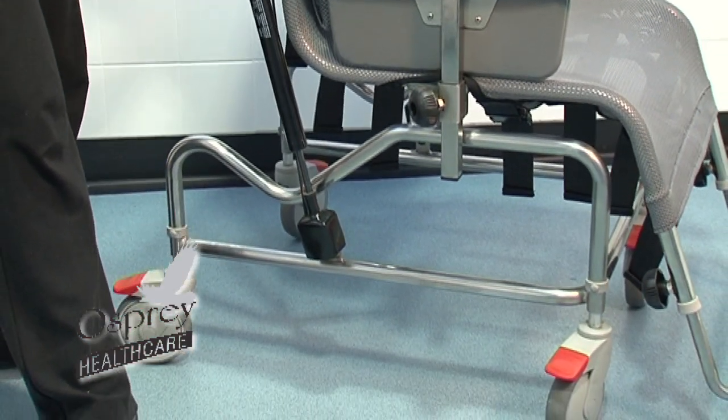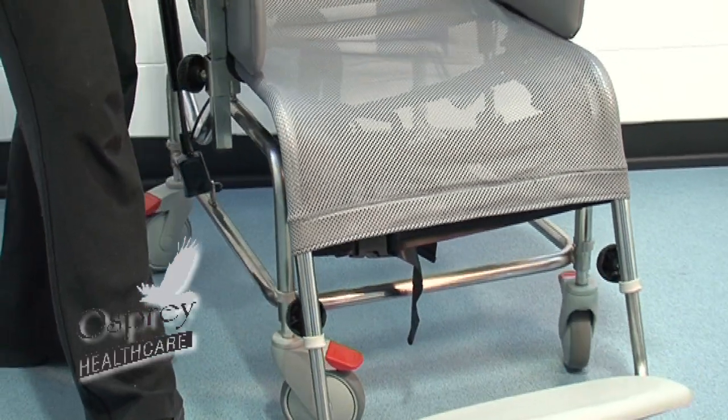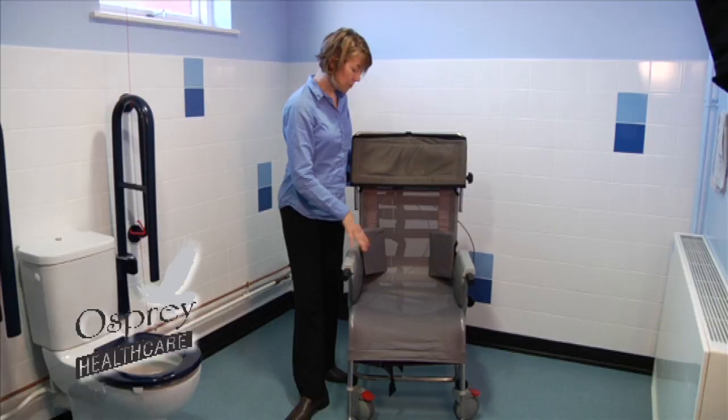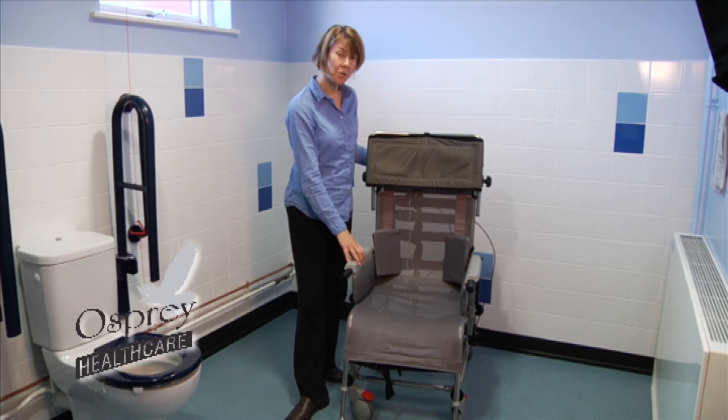There are four casters on the shower cradle, and it comes with attendant control casters. It does have additional trunk supports, straps, and wedges, which can help to support somebody who's got poor sitting balance or poor postural muscle tone.